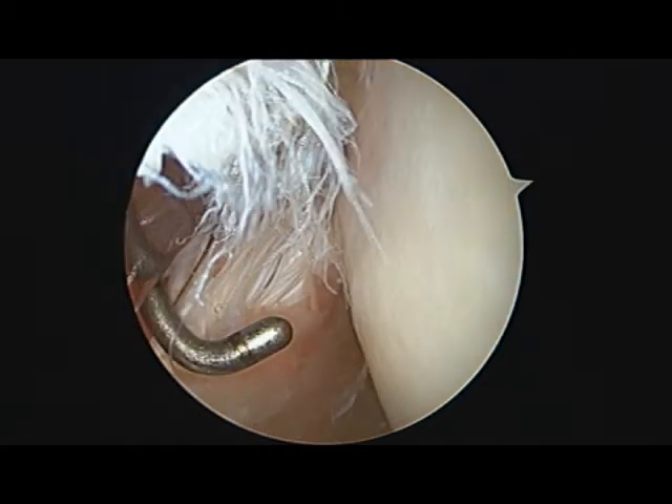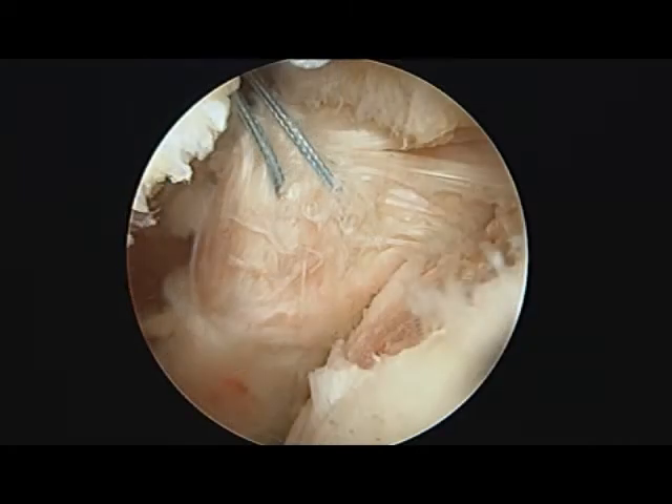This photo highlights one of the challenges of subscapularis tears: they're not all that obvious at the time of arthroscopy like a supraspinatus tear is. Instead of retracting away from its insertion, subscapularis tears tend to fold down from where they belong, almost like my pants do when I don't wear a belt. This photo later in the case shows the torn tendon more clearly, where I have sutures in the torn subscapularis and can pull the tendon away from the bone to make the tear more obvious.